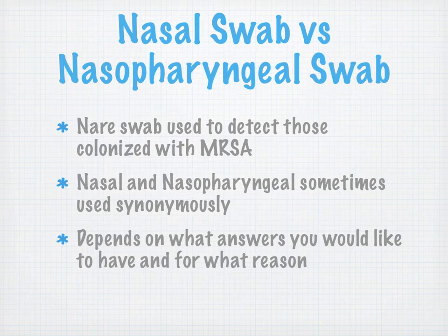Nasal swab versus nasopharyngeal swab. The nasal swab is actually used to detect people who are colonized with MRSA, methicillin-resistant Staph aureus. And then nasal and nasopharyngeal swab sometimes is a term used synonymously.